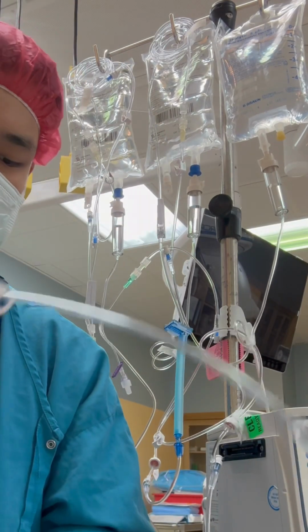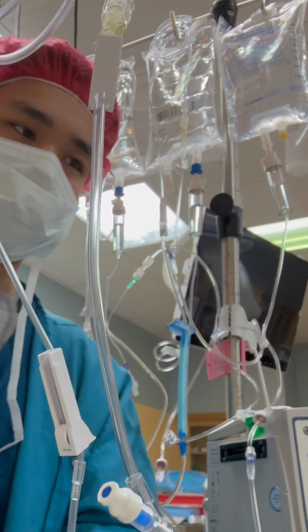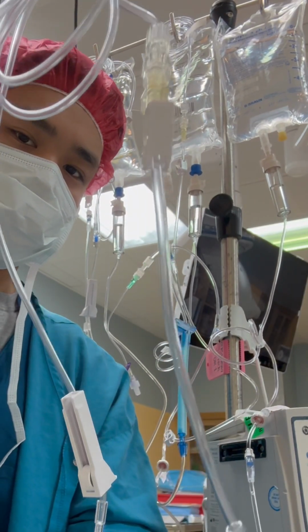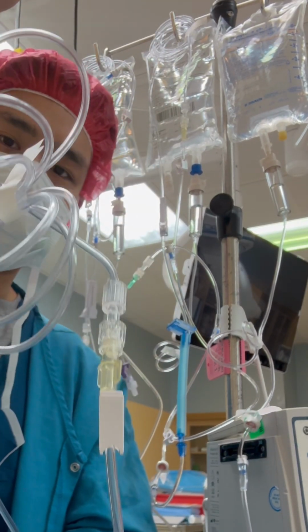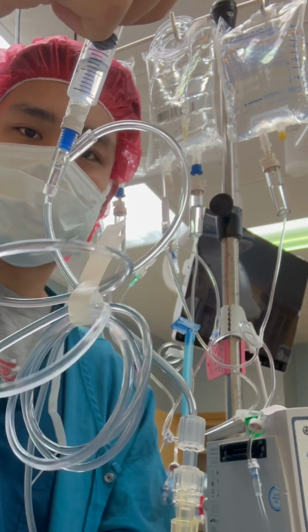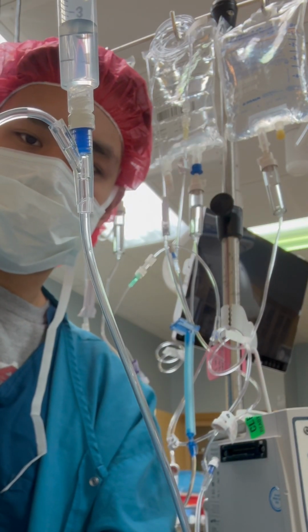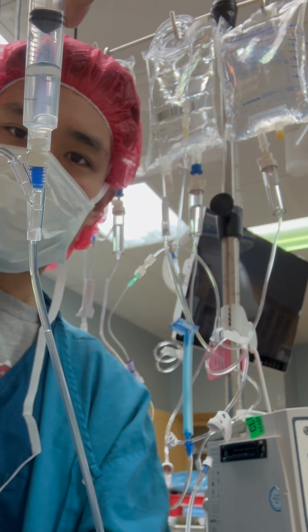Keep in mind, we're not using the roller clamp, we're using the pinch clamp. So it's a good trick to control how fast you want the tubing to prime by holding it how high. There we go, clamp. And that's another cc of air. Unclamp, clamp, aspirate.